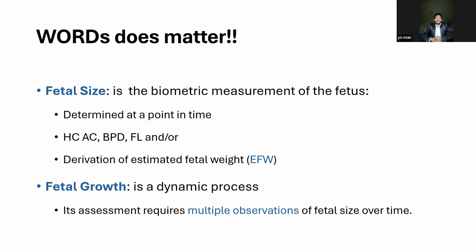So generally, when we talk about fetal growth restriction, we have to take care with words. Words will matter when we write a report about fetal growth restriction. So let us clear them out. The first thing is fetal size and fetal growth. There is a difference between fetal size and fetal growth.